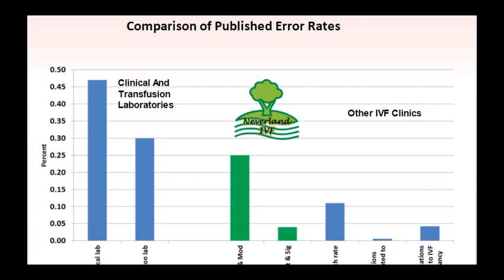One study showed that the total human mismatch rates were 0.11% and 0.12% during a comparison whereby both double manual and electronic readings were performed, and then the electronic system was used as a witness. When complications related to IVF were investigated, the complications directly related to IVF and those related to pregnancy were both below 0.05%.